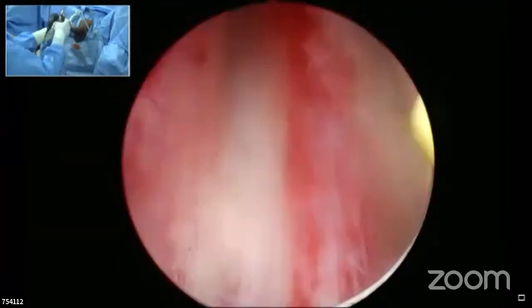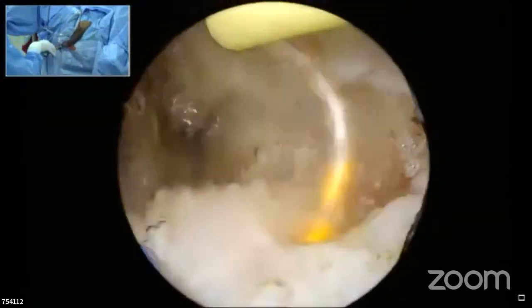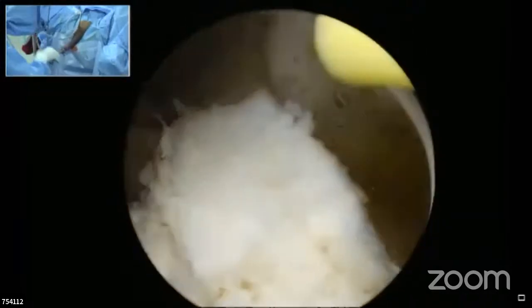Once we control it, like Taif has done a devascularization of the left lobe completely now, and that gland will not be bleeding at all. You can do the resection very fast then.